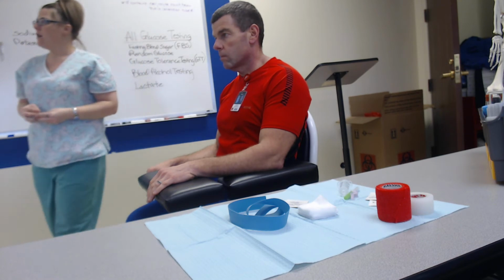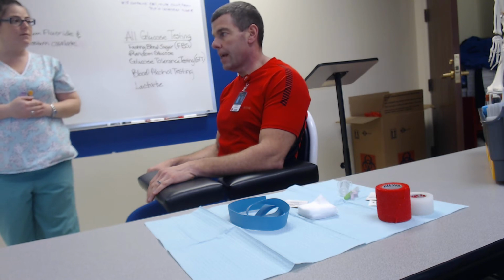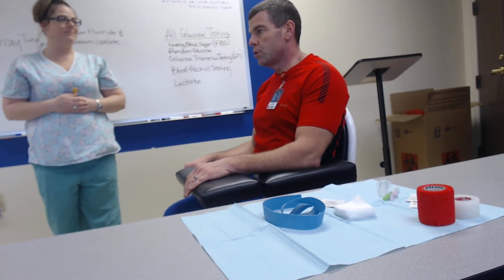Alright, so you have your patient come back. I'm going to call them back, and you want to verify their name, which is, may I have your first and last name, please? Yes, it's Kerry, last name Barnard. Great. Do you know your patient ID number? Yes, patient ID number is 2809.